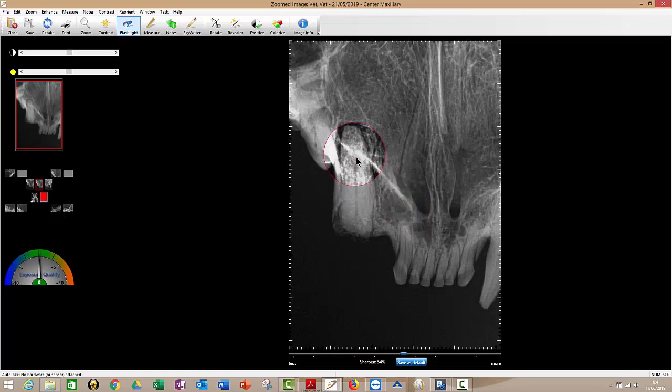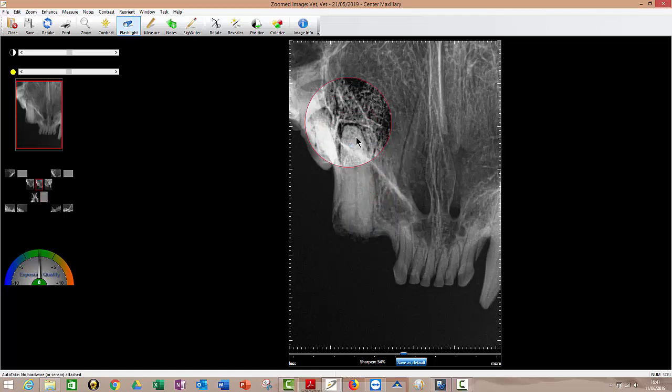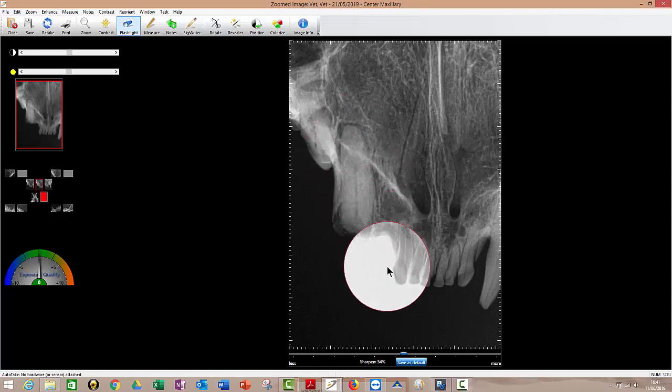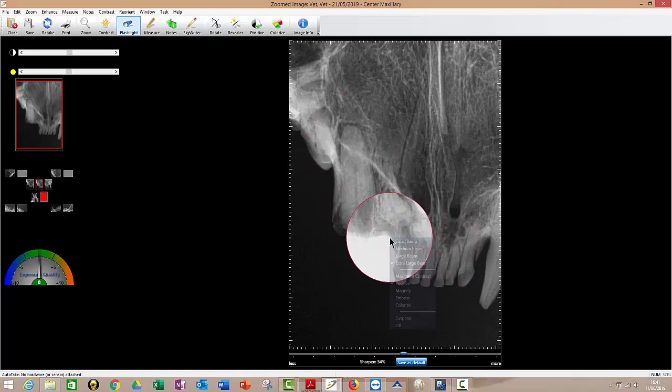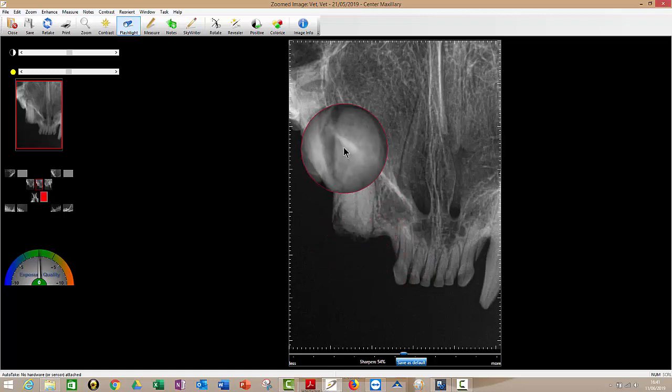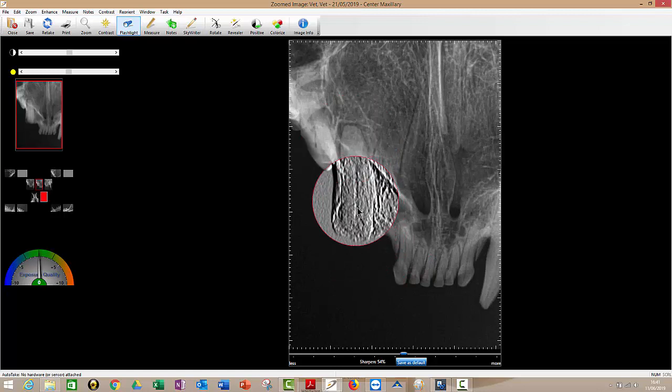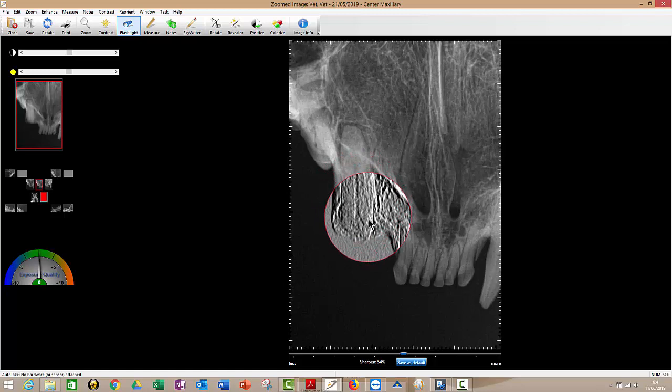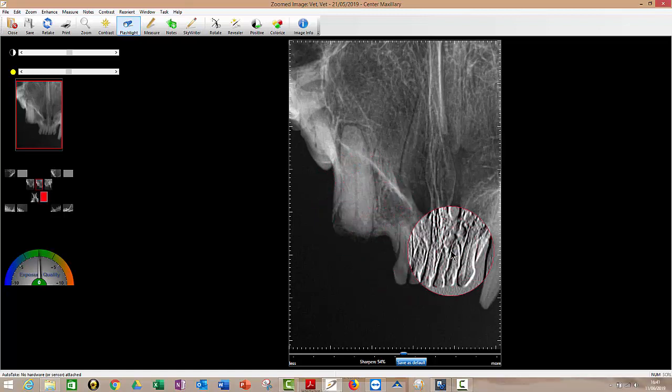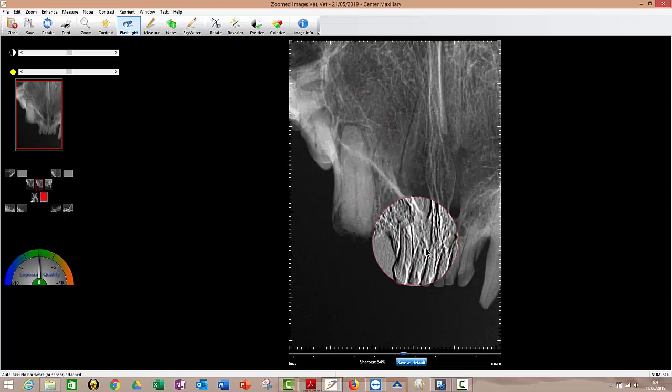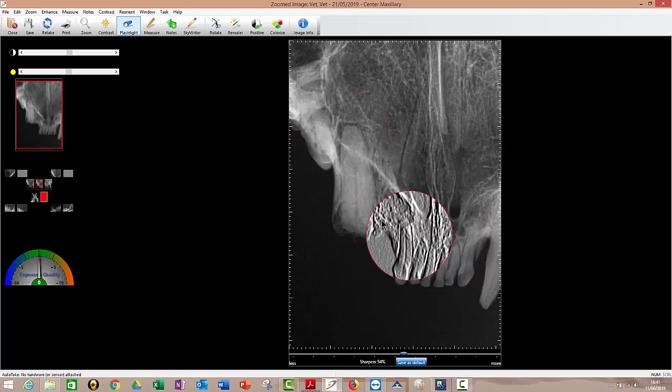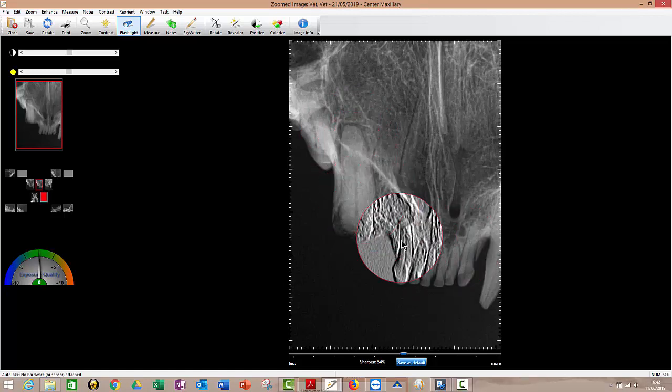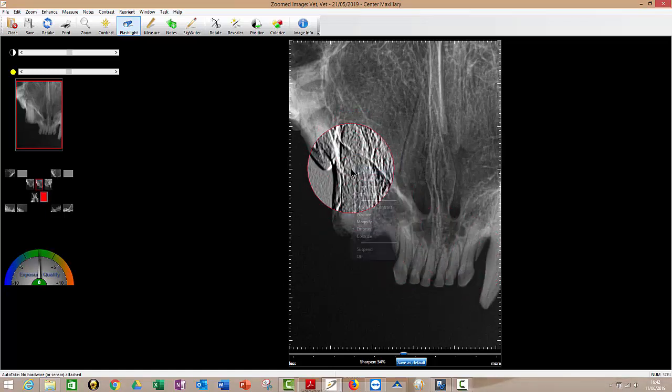So we're on flashlight at the moment. Now, if I right click, I have some other options on my flashlight. So I could make it an extra large beam if I wanted to. Right click again, I could make it positive, negative. Right click again, magnify, which does what it sounds like it does. Right click again, emboss. This one's quite useful. It sharpens up the edges for you. So again, if you're looking for a periodontal ligament that is in the process of resorbing, then sometimes this one helps you make that judgment call of whether you're going to go in and remove that root or not.